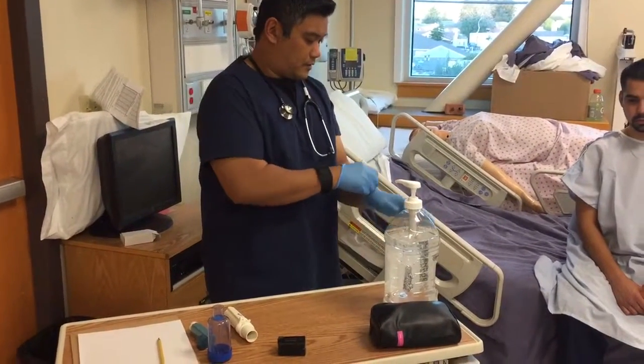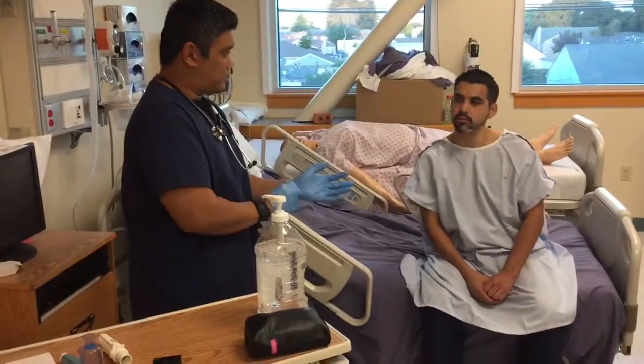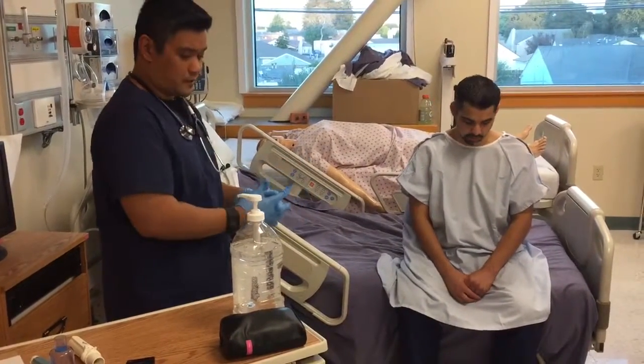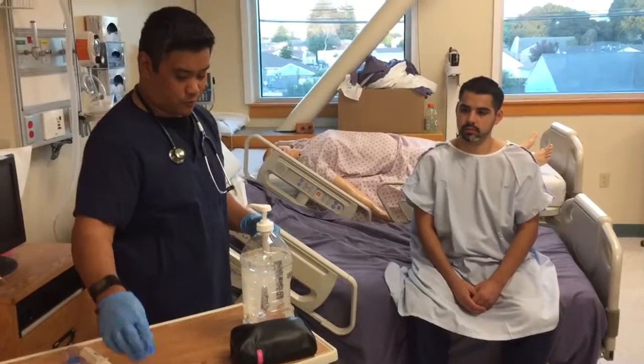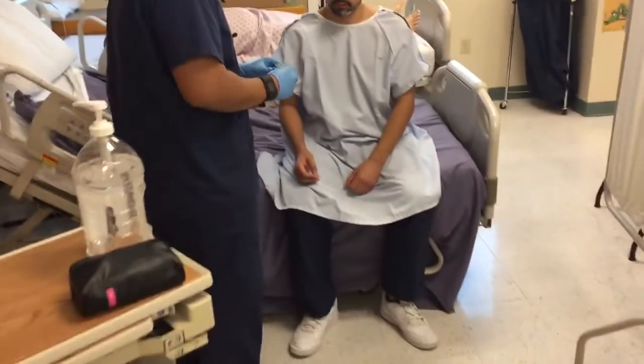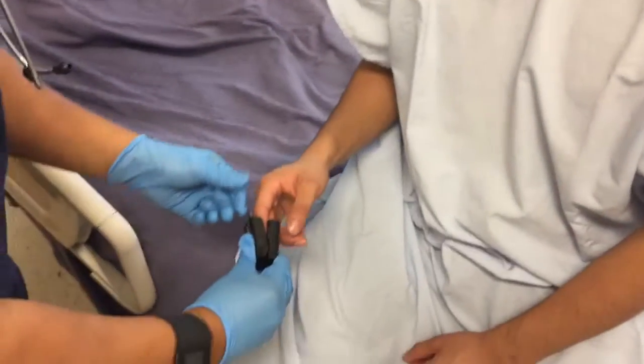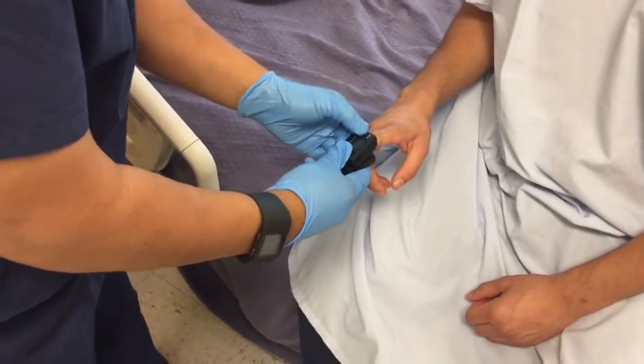All right, and may I call you Christian? Yeah, thank you, Christian. So we're going to be starting off with some vitals. I would like to check your pulse ox, as well as your pulse, and let's go ahead and put this on. Index finger. Let's turn that on.